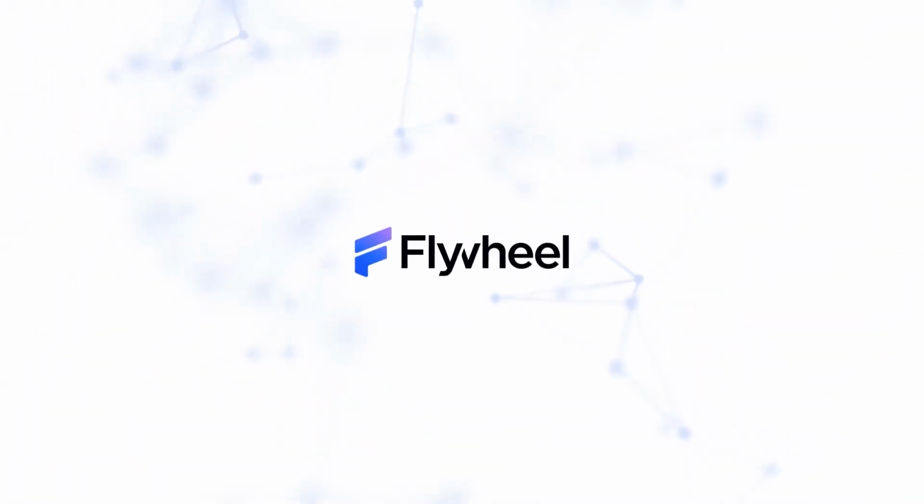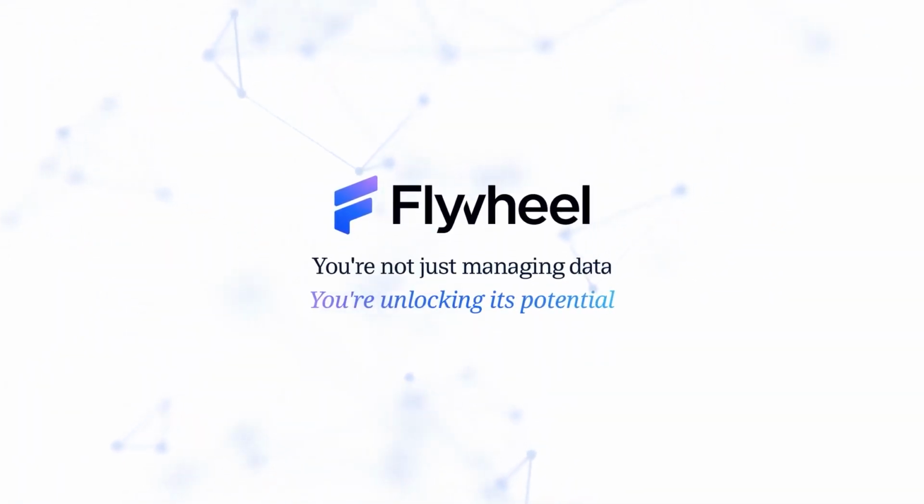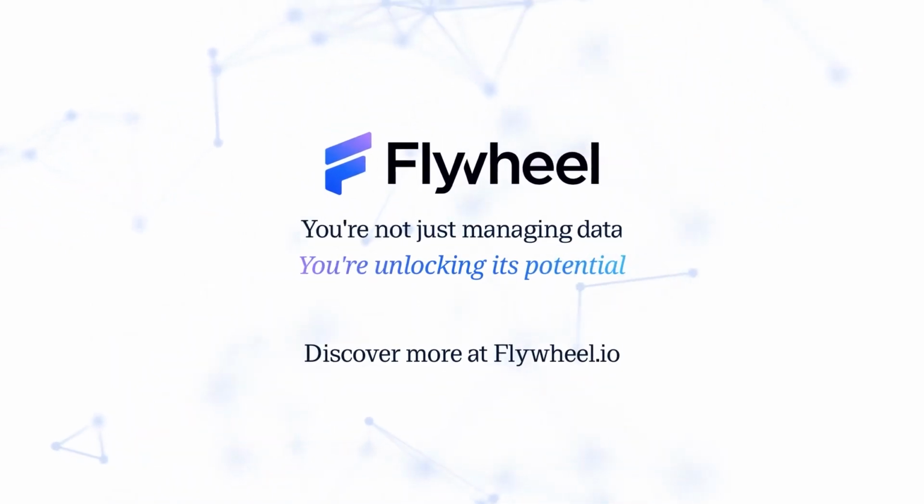Maximize the value of your imaging data. With Flywheel, you're not just managing data, you're unlocking its potential. Discover more at Flywheel.io.